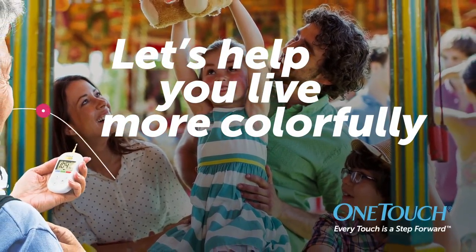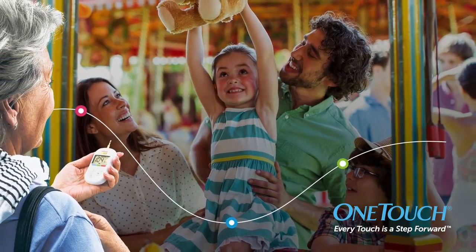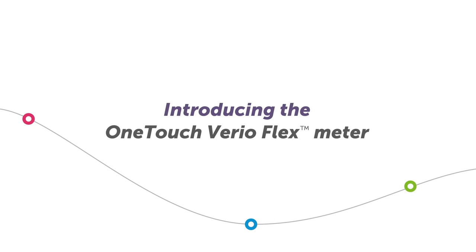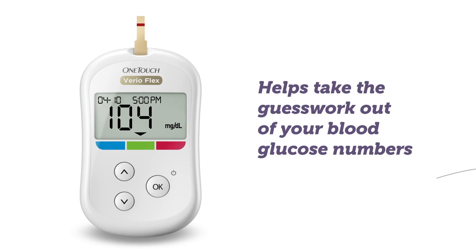In moments like this, you want to enjoy the times you prize the most. Introducing the OneTouch Verio Flex Meter. It helps take the guesswork out of your blood glucose numbers.